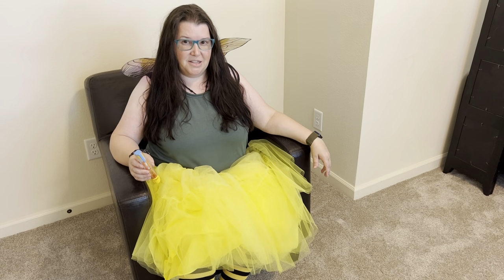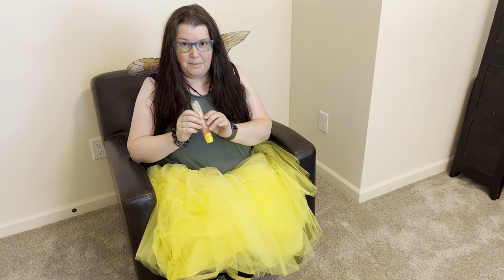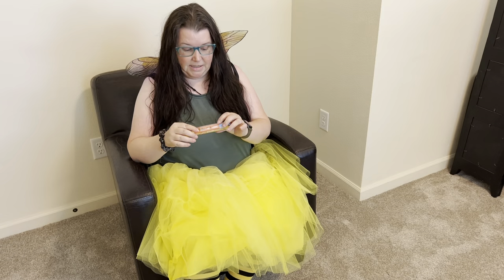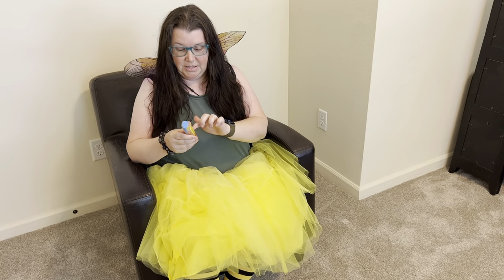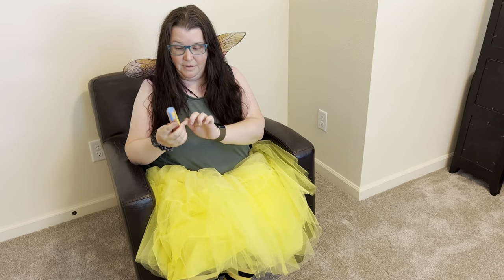Hello, Nurse Bee here to teach you how to use an EpiPen in case you are allergic to bees or peanuts. Every EpiPen is different. Make sure it is not expired. Make sure you always have a new one. And then follow the directions on the back of the thing.